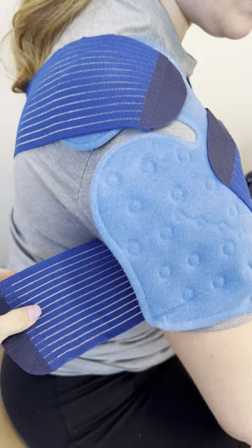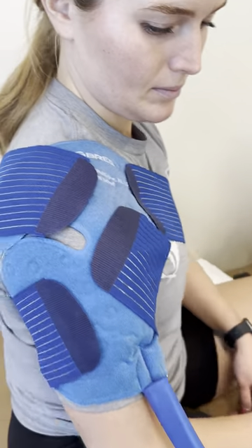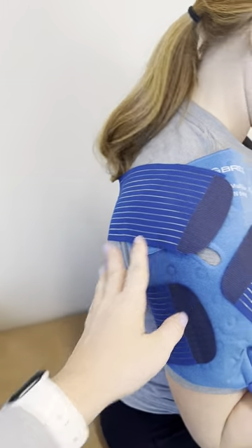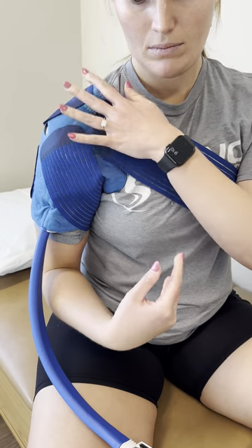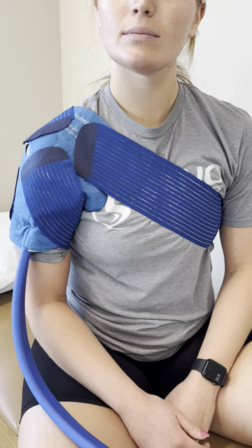This bottom strap will go underneath the arm and wrap around. The top strap is typically used behind the back and under your other arm to secure in the front. There's really no right or wrong way to put these straps on, as long as it's snug.